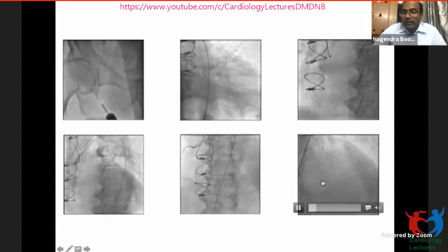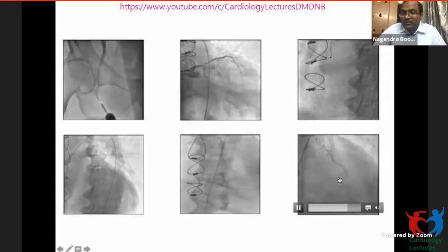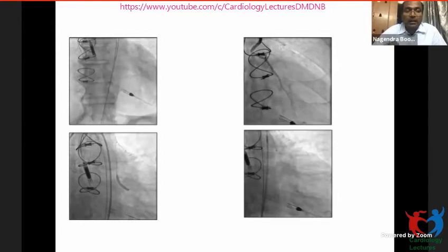Graft filling RCA. Then there's a tight left main disease. It was seen here, you should be able to see here, the tight left main disease in this particular position, and a distal anastomosis lesion. Impella was placed in the right groin. A single access Impella procedure was done.